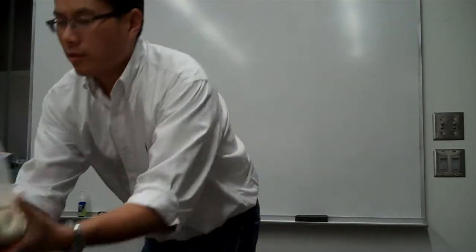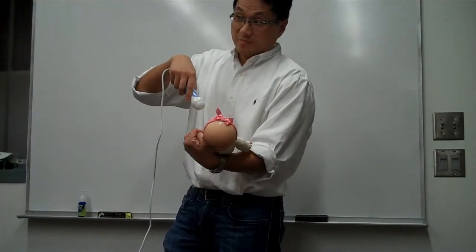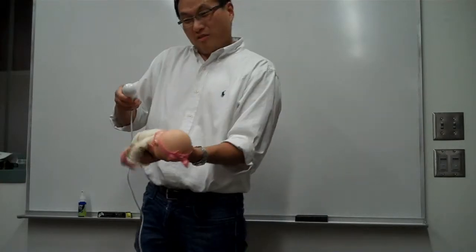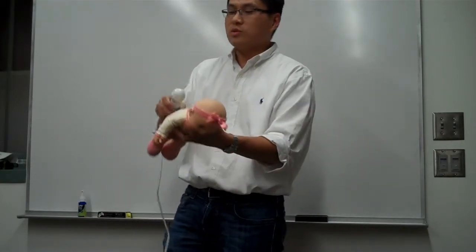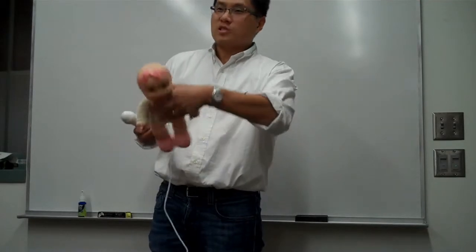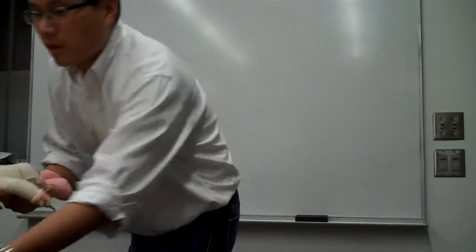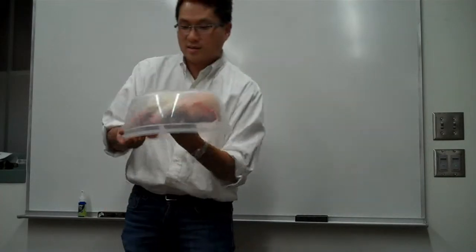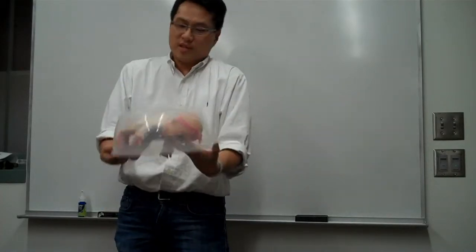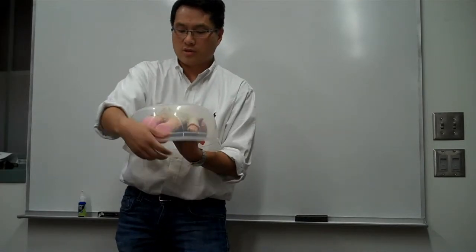Oh yeah, one other thing is, sometimes the baby's this way, sometimes the baby's this way. Obviously we want the baby to be in different positions, because we want to twist it or turn it, and then the baby flips over, and then you start practicing. So somehow the baby has to be able to rotate this way. I mean, this is pretty easy. You could just turn this. You can just turn it and scan it.